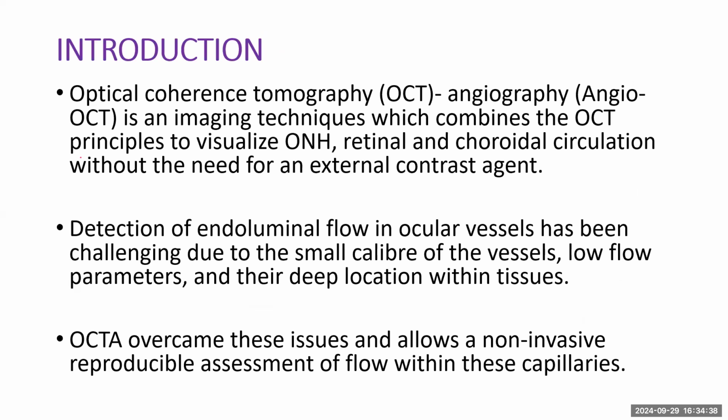After this had been stated, the next question was, how do we check the vascular supply of the optic nerve head in persons with glaucoma? How do we check it in persons that are normal? Several things came into place. The first studies were histopathology of persons who were already deceased, and it showed that their nerve fiber layer thickness was reduced and the vessels were also reduced.